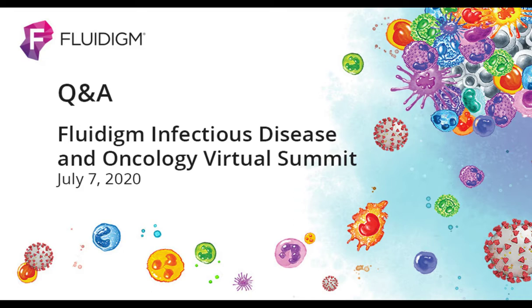Now, Dr. King, I do have a 2-part question for you. Compared to the LAMP method, which no RNA extraction step is required, are the 5 microliter pre-treated samples subject to RNA extraction to obtain the quality RNA first, then loaded for this Advanta DX assay? And without high-quality RNA, do you still expect to get accurate results?